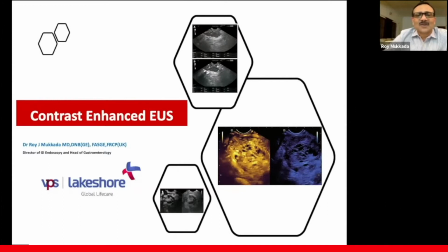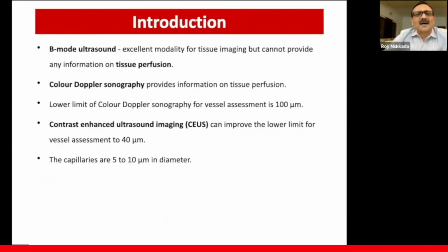Thank you, Malay. So, contrast enhanced EUS is an excellent mode. I will come to that with a few basics and then the clinical application.